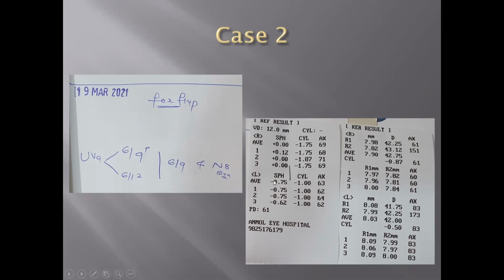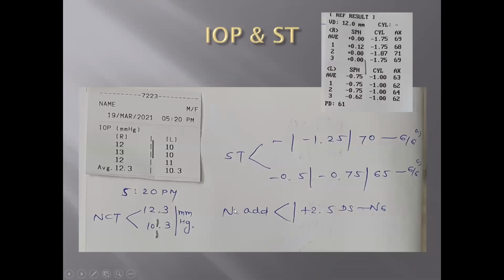While in the left eye, you need some sort of spherical first or spherocylinder for the correction. So in this also, as the keratometry is giving 0.5 cylinder only, this cylinder may not be required, or only 0.5 or 0.75 less cylinder may be enough to correct the refractive error. So in the left eye, the combination of spherocylinder must be needed. Let's see the final outcome.